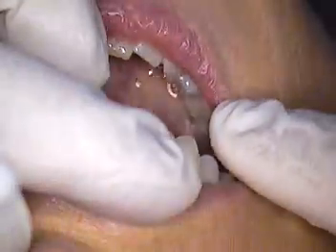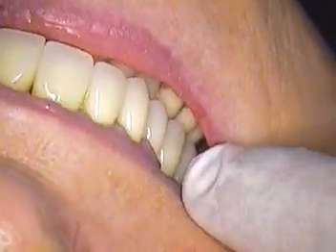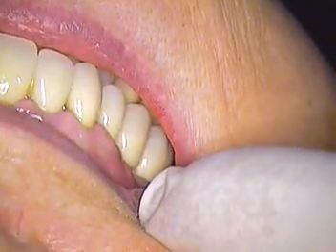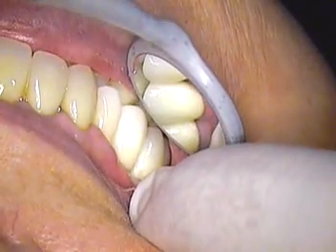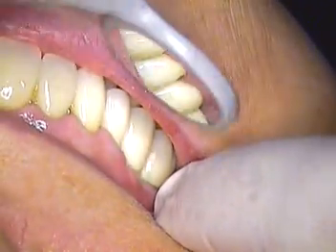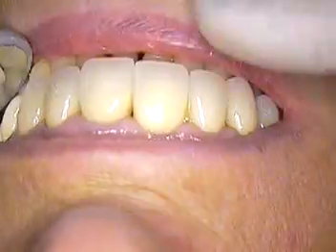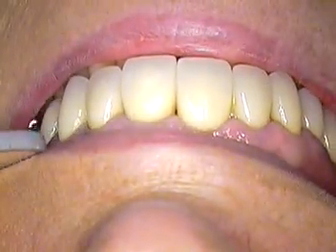There we go. And bite together, June. Okay, good. Tissue adaptability here right up to the soft tissue, which is keratinized. That's what you want to see. And we're looking at this side to compare. I think we're doing a pretty good job.